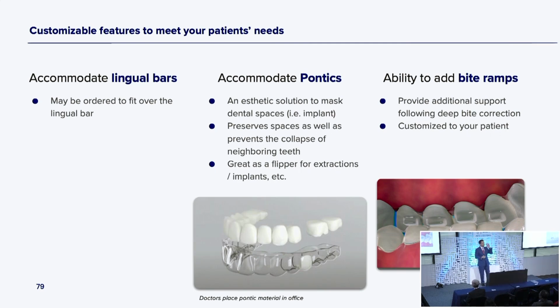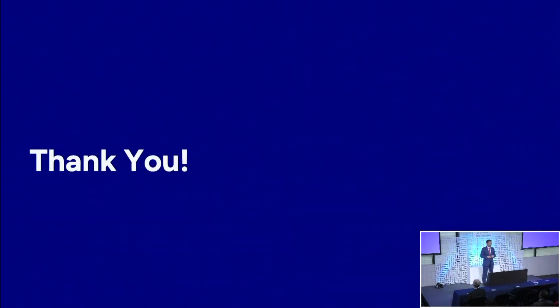Bite ramps, if you go far down the road and you're thinking about bite ramps on your retainer because you want to keep them open more, tongue space, airway, not for today, but bite ramps are optional if you so choose to use them.